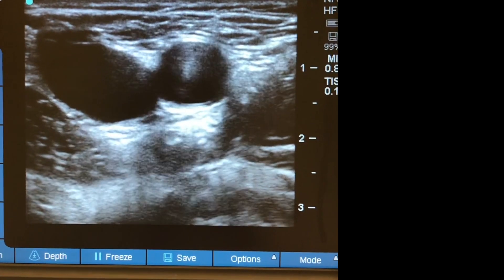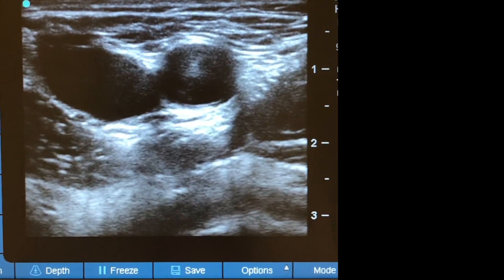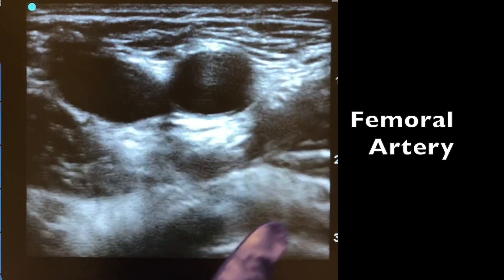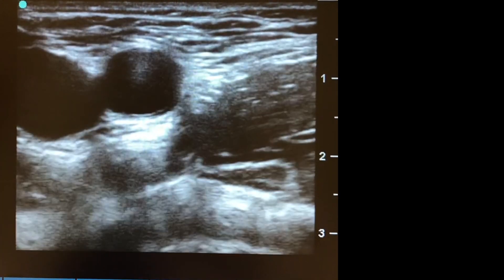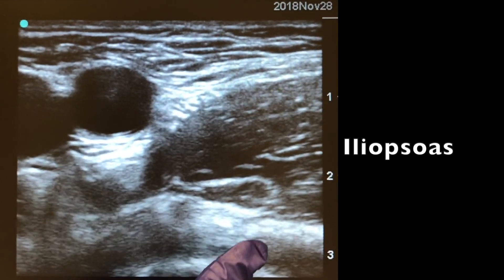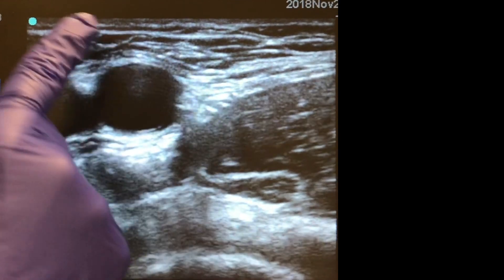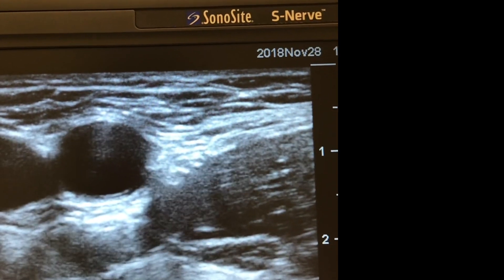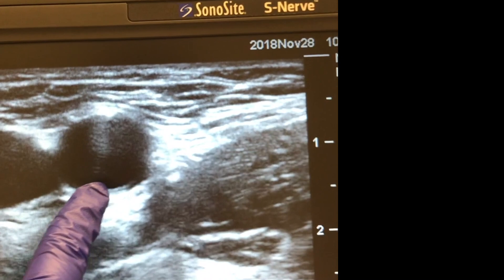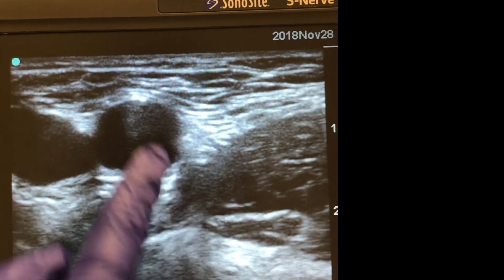For the femoral nerve block, I'm using the probe to look at my femoral artery area. The pulsating hypoechoic structure is the femoral artery, with the compressible vein right next to it. The large hypoechoic muscle is the iliopsoas. The hyperechoic structure below is the femur. Above, you have the fascia lata as a hyperechoic line, and underneath the artery you have the fascia iliaca. The femoral nerve sits below the fascia iliaca, right next to the femoral artery — that's your target.